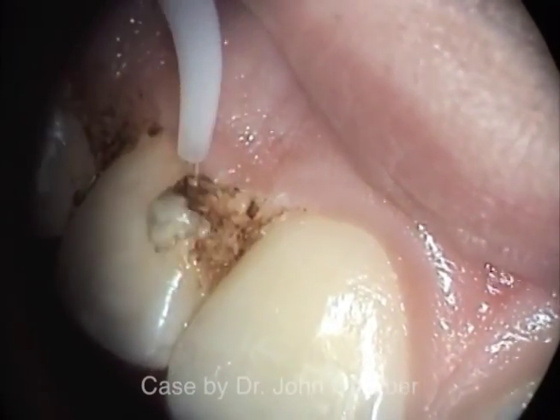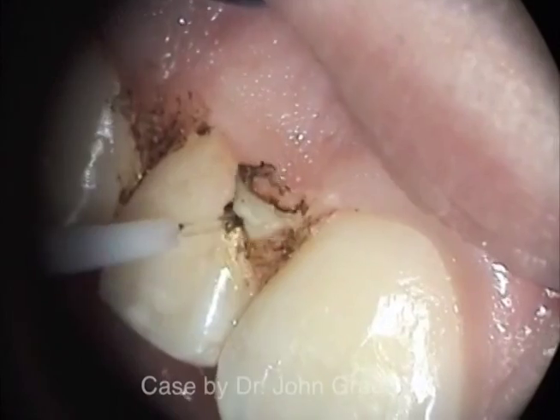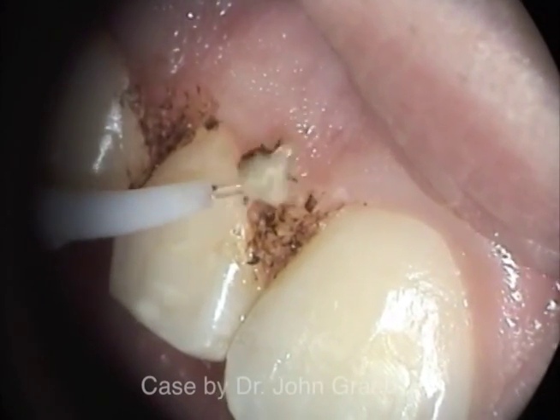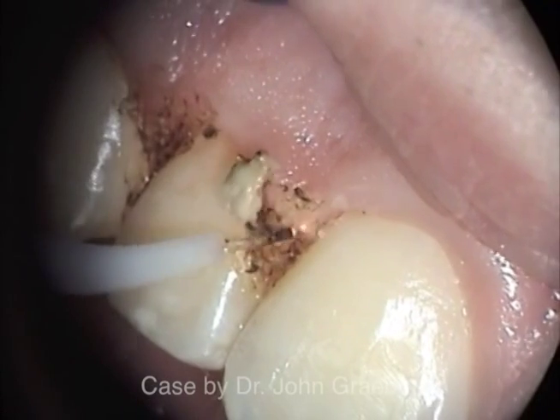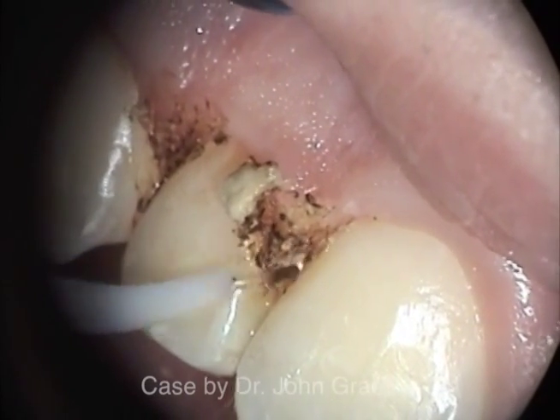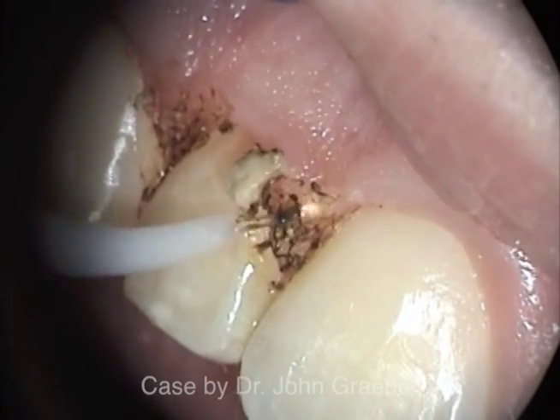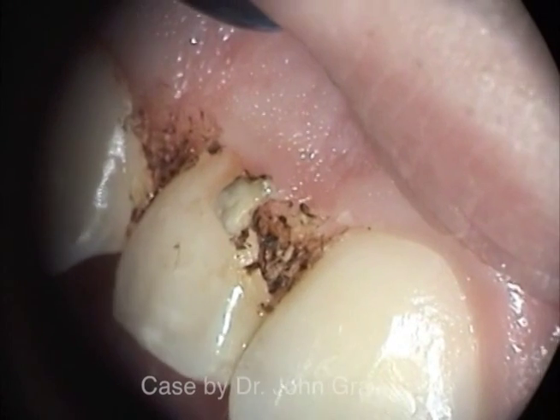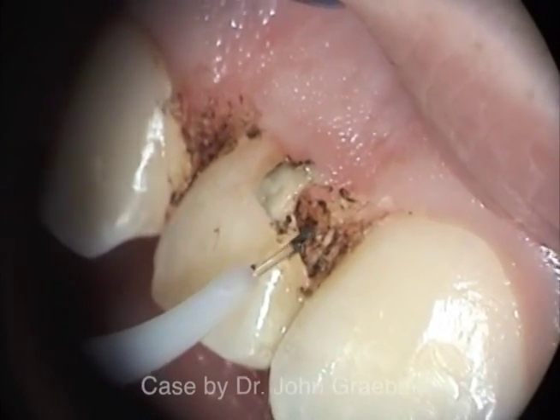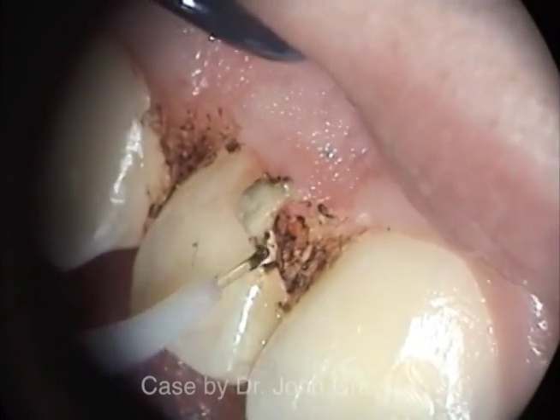Further refining of the excision can be done at this stage of the procedure. The blackened tissue tags may be removed using a liquid such as hydrogen peroxide 3% or water, and gently scrubbing the lased area so the immediate post-operative appearance is improved aesthetically.